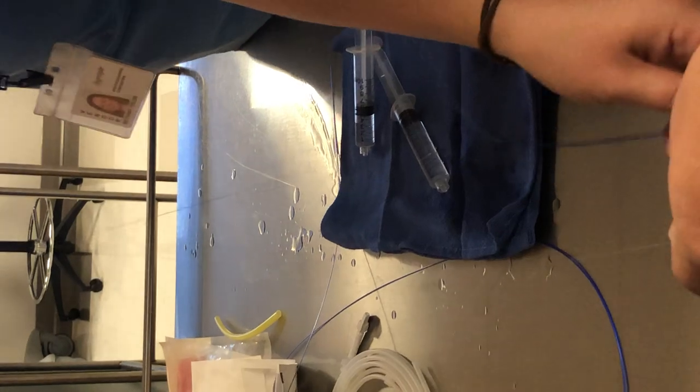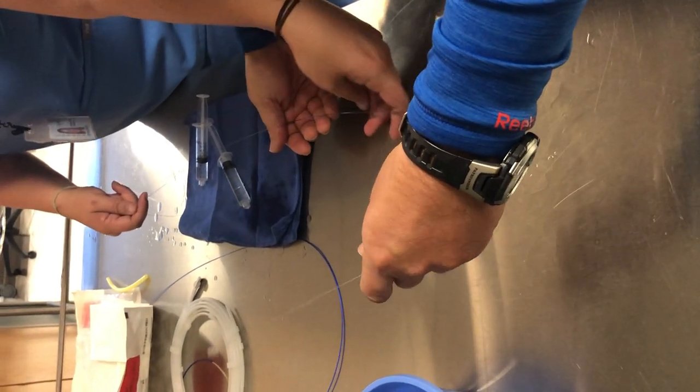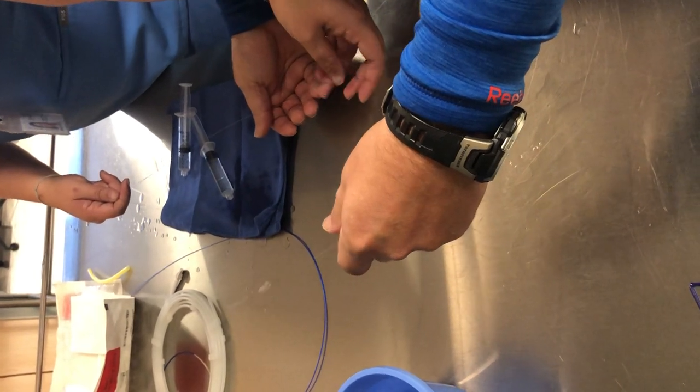This is going to go through the hemostatic valve up to where we have it in the carotid. There is a distal marker on here.